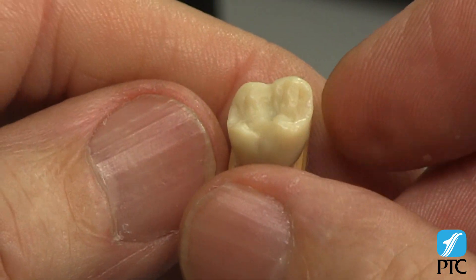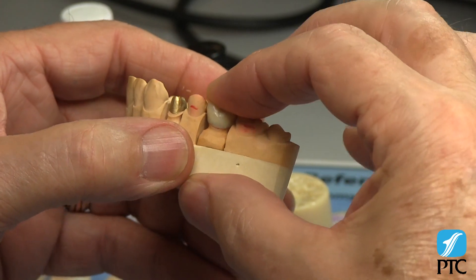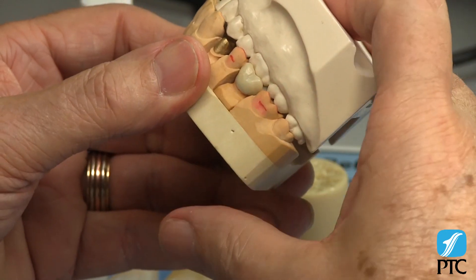The Occlumaster patterns are available on the PTC website in four different occlusal designs. All the waxing procedures you've seen here are taught in the PTC anatomical waxing course in Morgan Hill, California.